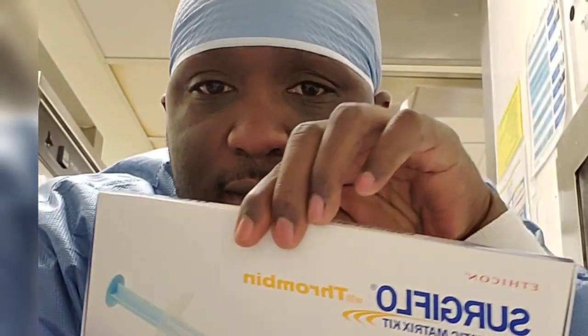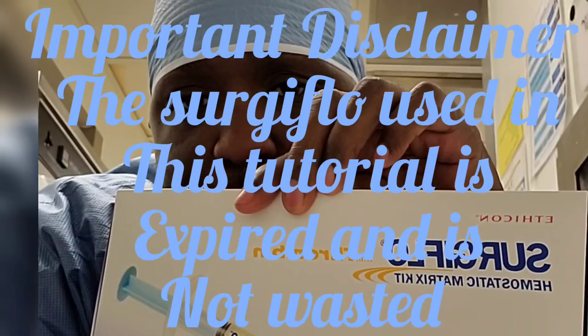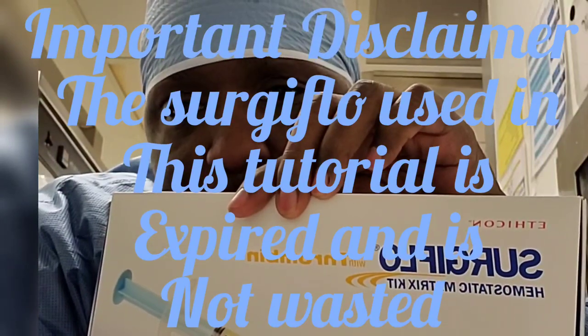Welcome back to Parasquerations. How are you guys doing today, my surgical family? Thank you guys for all the love and support. On today's video we're going to do a quick video on a hemostatic agent called Surgiflo. I'm just going to show you guys how to put it together. It's used to stop bleeding. We're going to show how to put together the Surgiflo, coming with thrombin — how to put them together and how it's used.